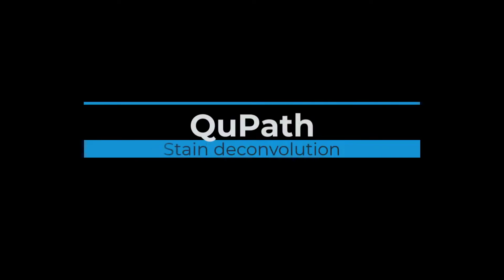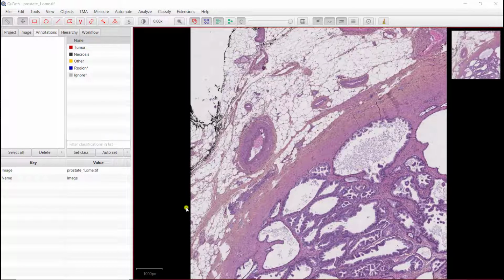In this video, I'm going to show you how you can deconvolve stains. Here we have an H&E image that's been scanned and is defined as an RGB. So to have the colors, we have a channel in red, a channel in green, and a channel in blue. We're going to try to change the way the colors are defined to actually define a channel for hematoxylin, a channel for eosin, and a residue channel.